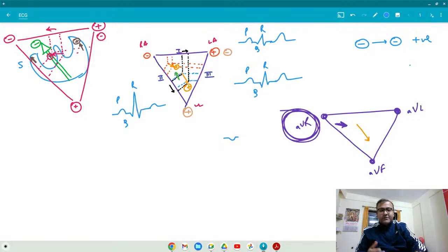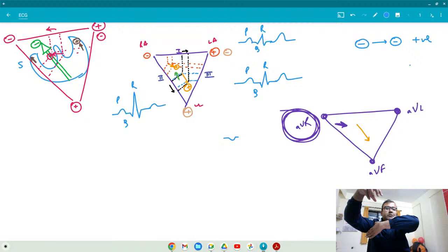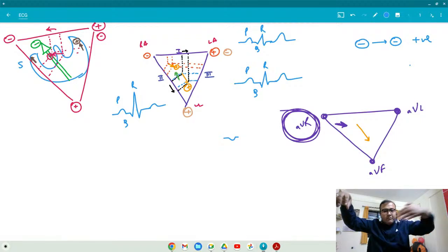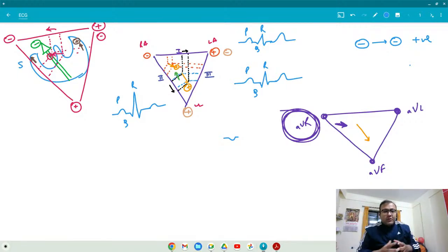So simple. Why are you complicating it? It is very easy. You are standing over here and the train is moving in this direction. You will be able to see the tail of the train, of course. But by that time, the train has reached a different station. We are talking about when the train is passing. So is the train coming towards you or away from you? Towards you. So that means the deflection should be what kind? Positive deflection. Yes, so simple. You're doing it all correct. Why are you confusing? It's positive deflection.